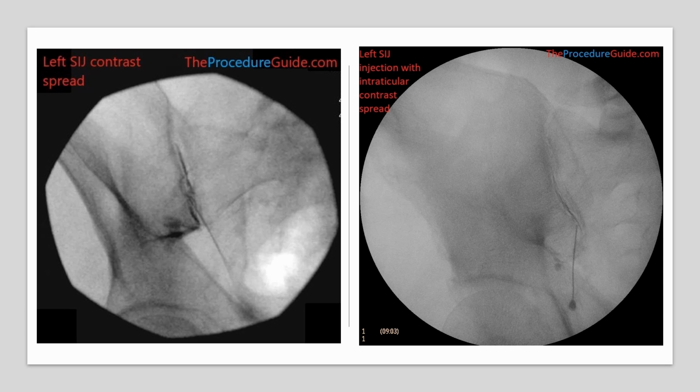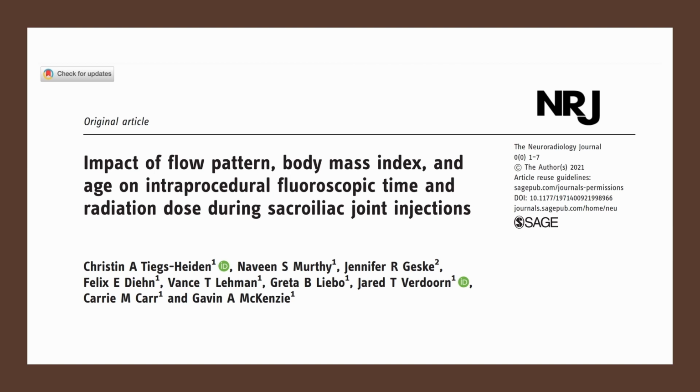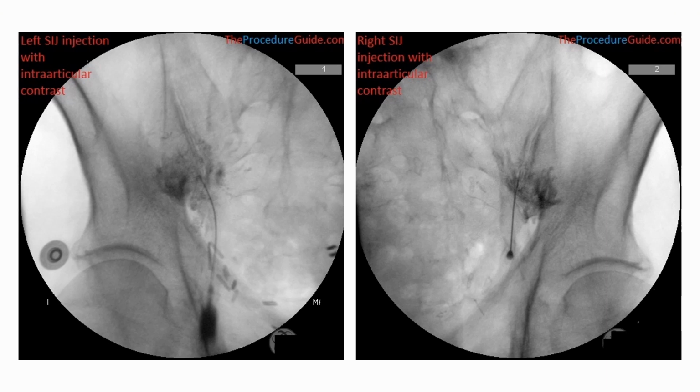You need to maneuver the needle in various directions until you feel it enter the joint, requiring anesthetization of the area before the procedure. Furthermore, intra-articular injections can be time-consuming, with the mean fluoroscopy time reported to be approximately 1.56 minutes. There's also a high risk of contrast contamination or technical failure.